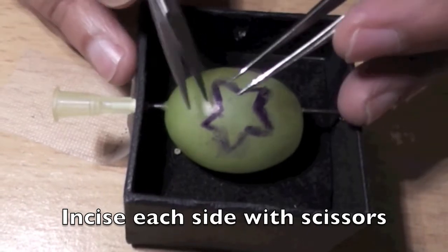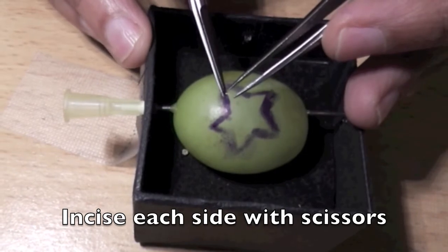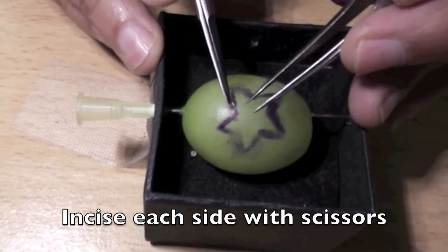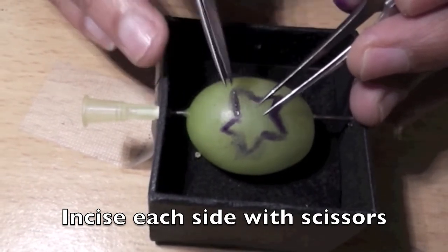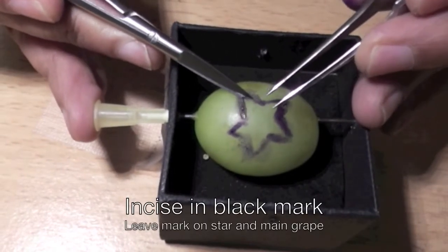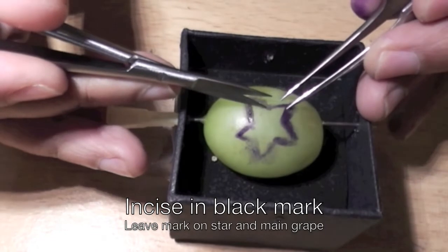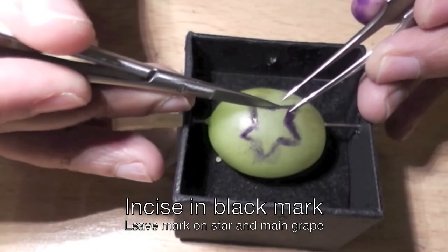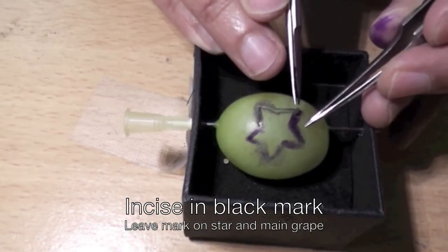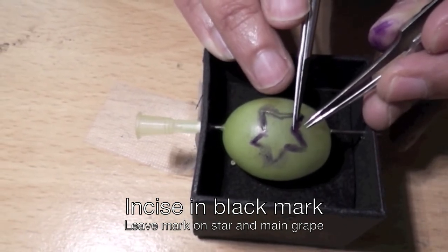Okay, star's the limit task. What I'm going to do is cut within the black line of the star. It has to be exactly within the line, and the aim is to ensure that you don't cut into any of the flesh of the grape. You have to make sure that you're exactly halfway in the black line, so leave some black colour on the star and also on the grape.